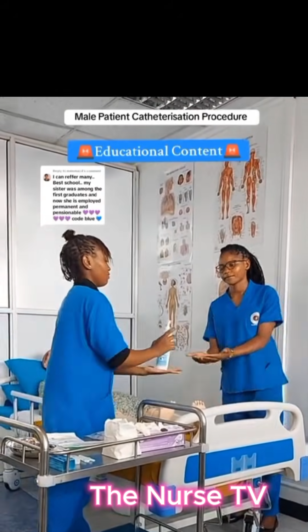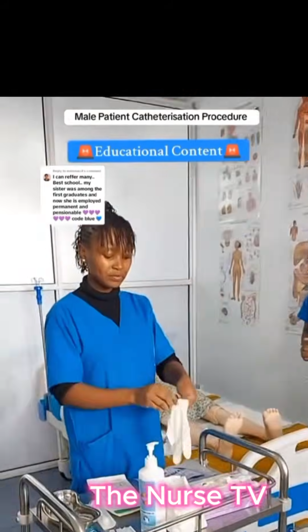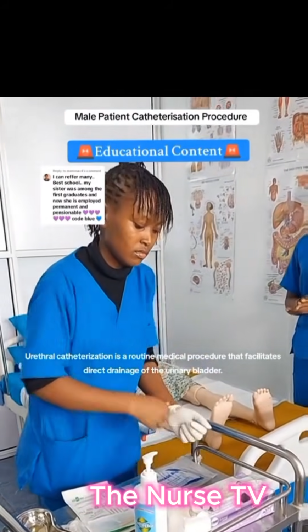Why do some patients need catheters? Nursing edition. Urethral catheterization is a routine medical procedure that facilitates direct drainage of the urinary bladder.